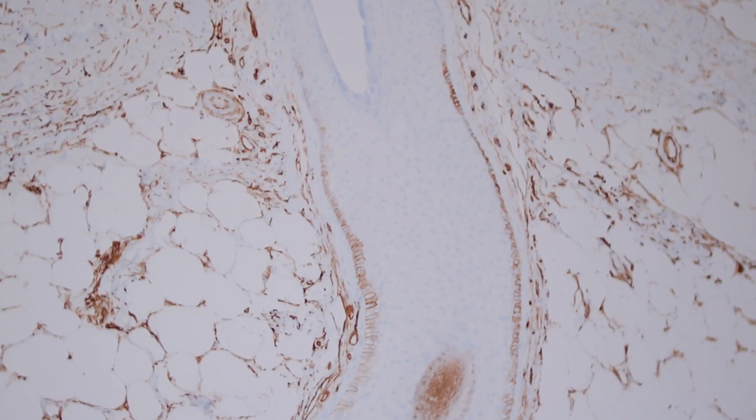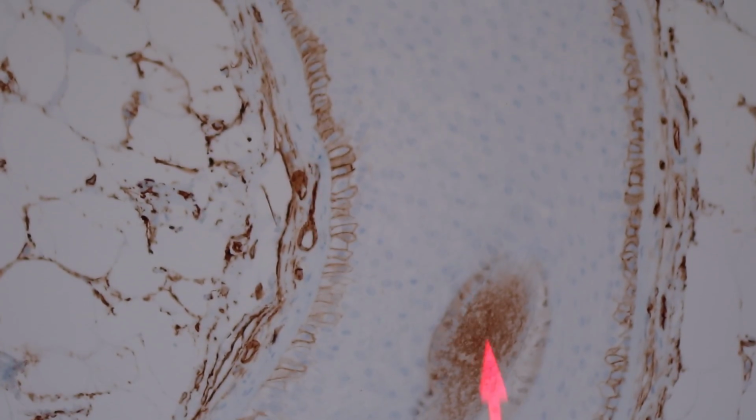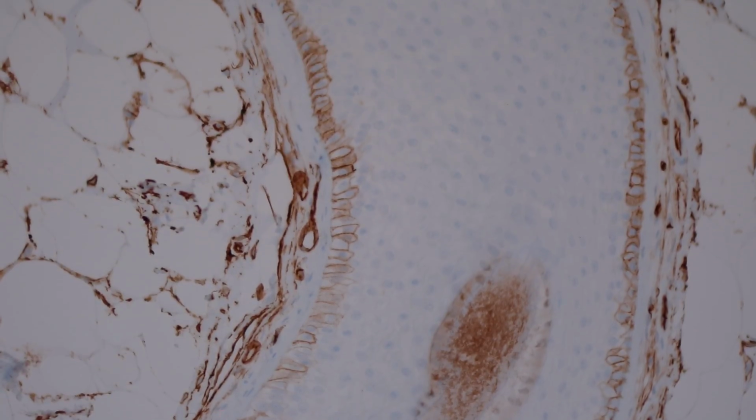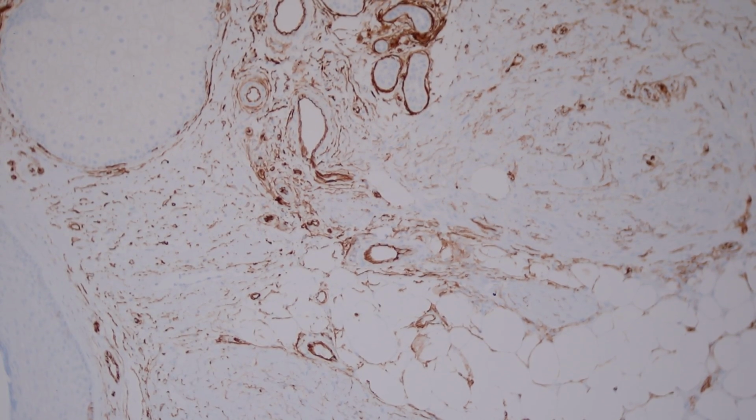One other kind of interesting thing that's probably not of great importance in general practice is, again, I mentioned that the hair follicle structures are really complicated, and we're not going to really go into them, but look, CD34 does actually stain the outer root sheath, this outer layer that looks like piano keys, in the root portion, or the portion below the hair bulge that goes down to the root of anagen hair follicles. There's nice membranous CD34 staining in this area, which is just kind of an interesting finding that all the other epithelial structures here are negative, but this outer layer of little piano key looking basal layer of the outer root sheath is actually positive for CD34.